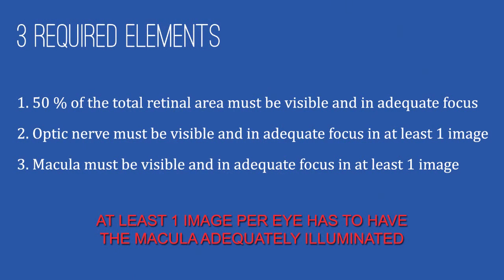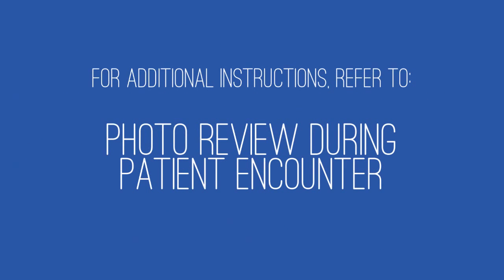Keep in mind that at least one image per eye has to have the macula sufficiently illuminated. To learn how to review photos before the patient leaves, refer to the photo review during patient encounter video.